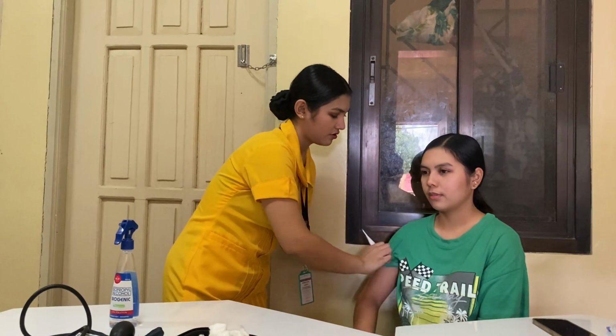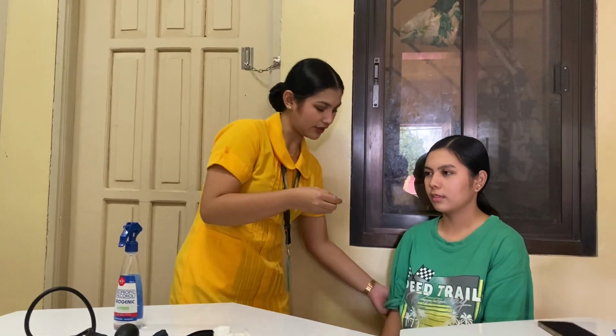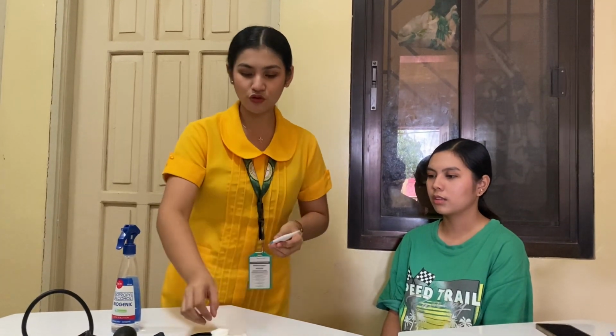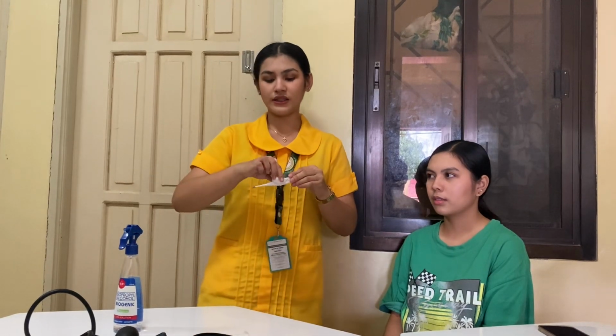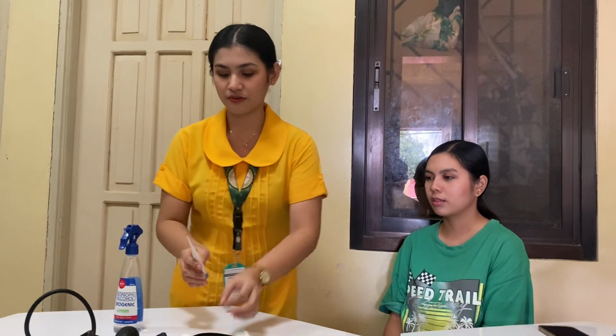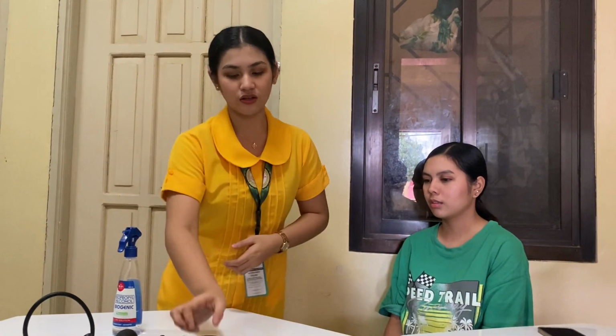Okay. So we're going to read the temperature, and the client's body temperature is 36.5, which is normal for the axillary. So after use, we're going to clean it from stem to bulb. And then dispose of this. And then rearrange the thermometer and place it in the storage location. And then after that, we're going to document the client's body temperature on the client's chart. So after that, we'll proceed to the apical radial pulse assessment.